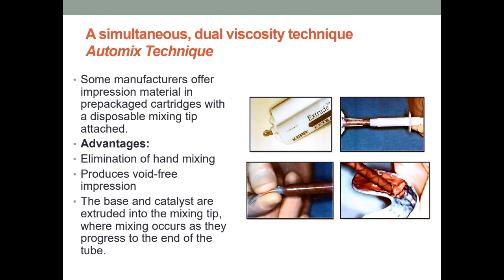Now the same technique can be used with the auto mix technique. In this technique, we don't require multiple people because such type of machines are available, which are static mixing machines, which are easy to mix and fast also. So the advantage is hand mixing is not required, so the mix is free of voids. The base and the catalyst exude from the tip of the syringe, as you can see in the picture.